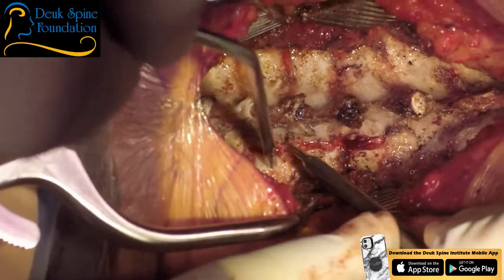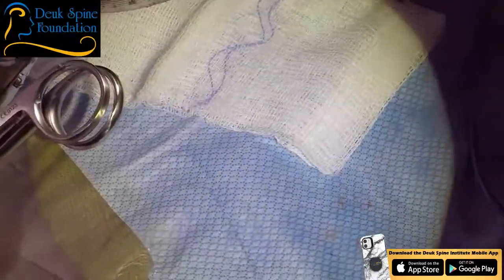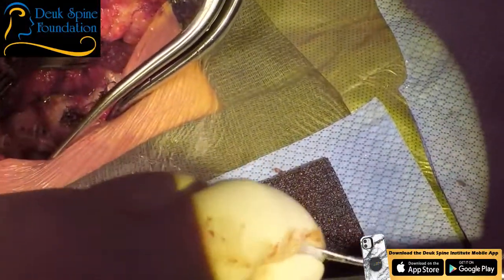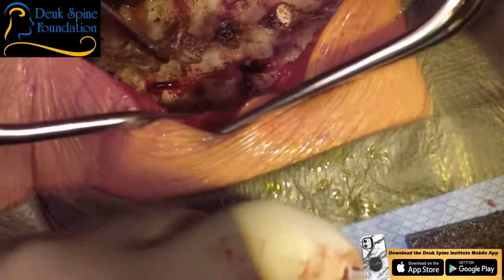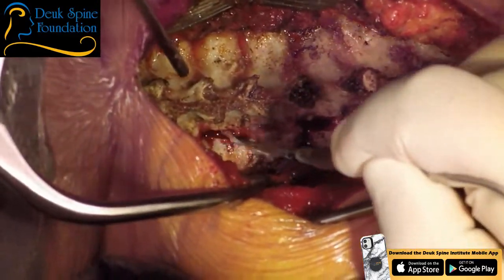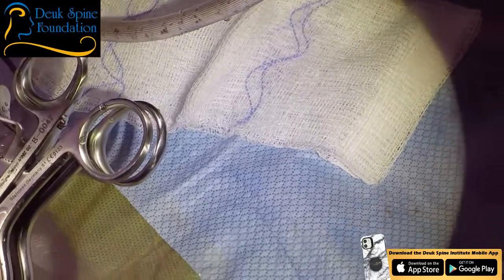I think that's good. We're through. Are we bleeding a little? Let's have some bone wax on a stick. Now remember, she has healthy diploic bone, so sometimes you're going to get some diploic bleeding of the residual laminar edge, and you can sometimes just use a little bone wax. You don't want to get too crazy with the bone wax. Let's check it out. Let's go Gelfoam. This looks like epidural vein, in which case you won't get it with bone wax. You want to use some Gelfoam with thrombin.